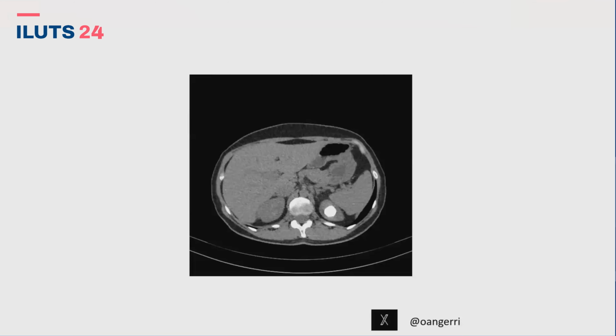In this case, for this diverticulum, I have to see the morphology with contrast. I don't know if there is a communication. There is no communication in the pyelography. At least in the pyelography. In this case, I suppose I would perform a ureteroscopic diagnosis and inject contrast inside, and if I can't see the communication on the infundibulum, in this case I think the best option for the patient is a laparoscopic approach, perhaps.